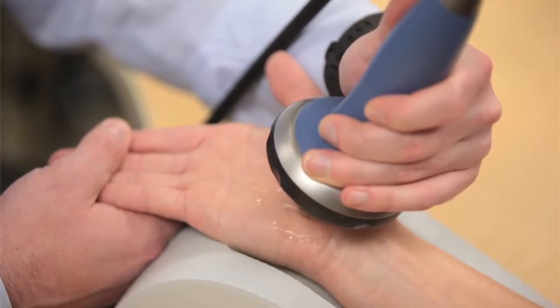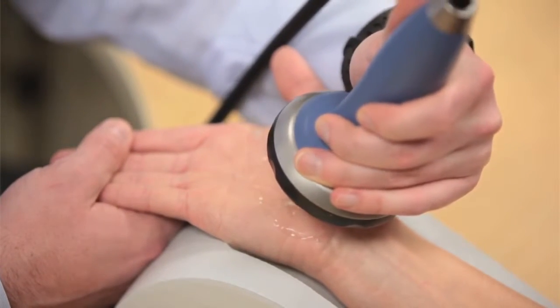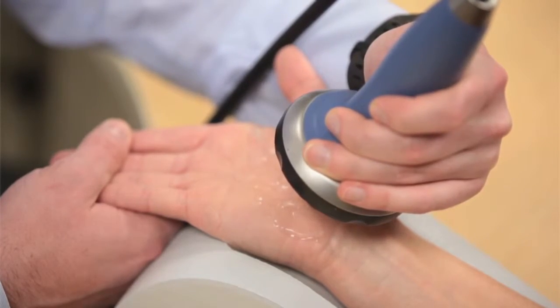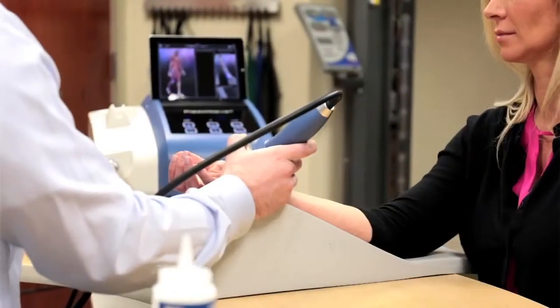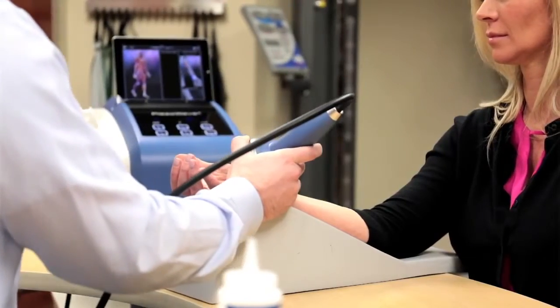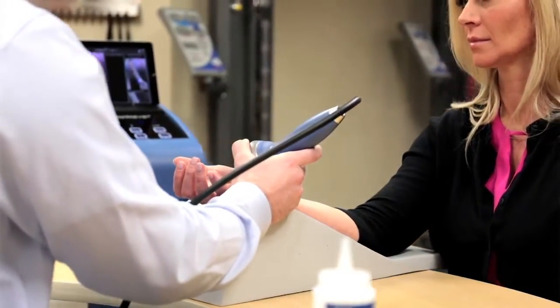Once established, the position of the therapy source is maintained on the area that is being flared, and the patient is instructed to confirm that the proper flaring position is maintained throughout the treatment, as well as providing the clinician feedback on maintaining a comfortable intensity level.